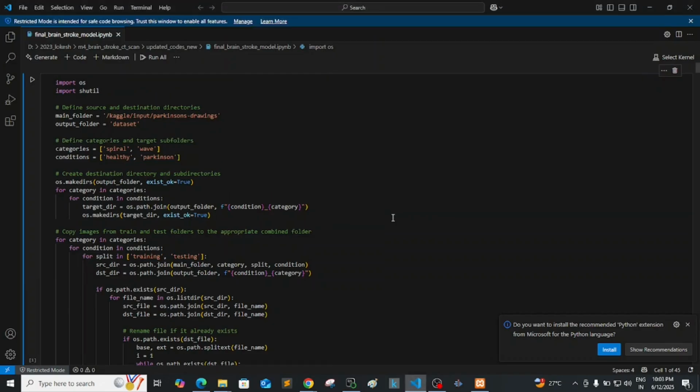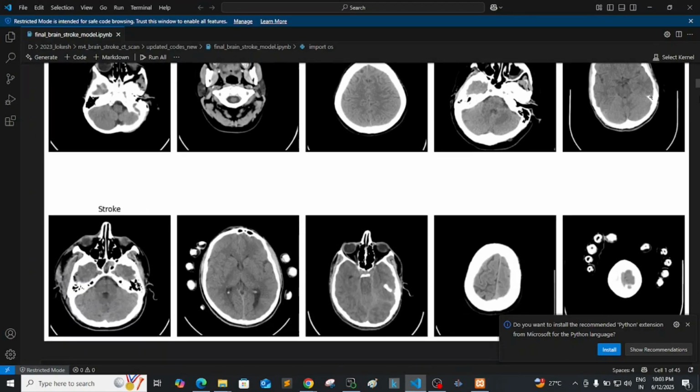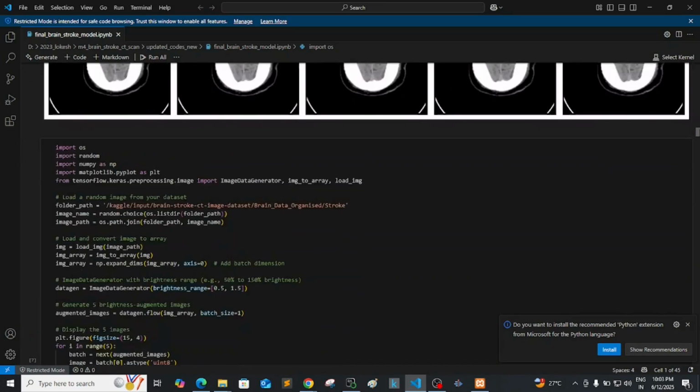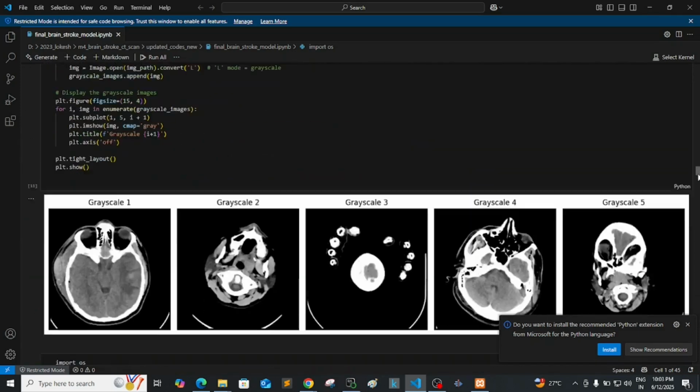If I show you what pre-processing we did and why we did it, I will explain the other things theoretically.